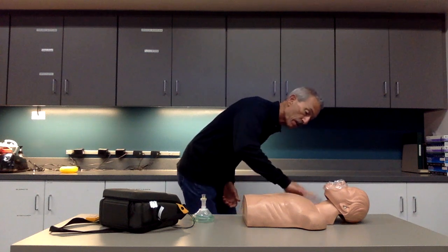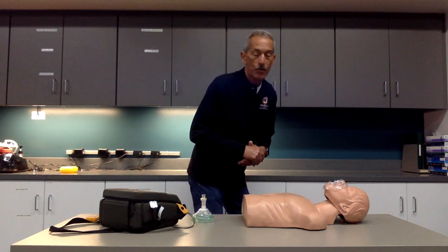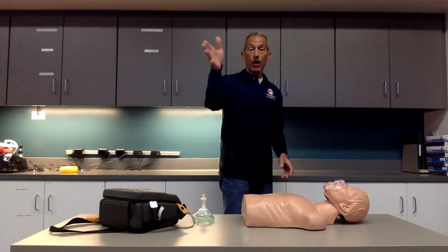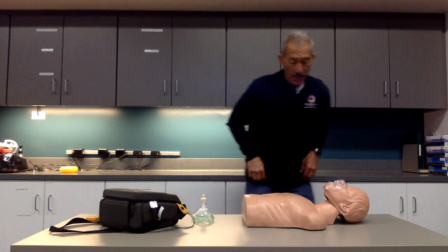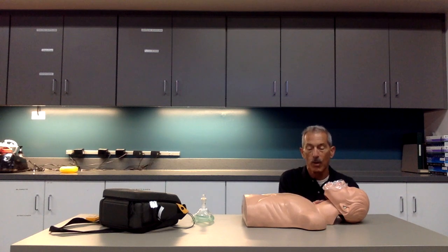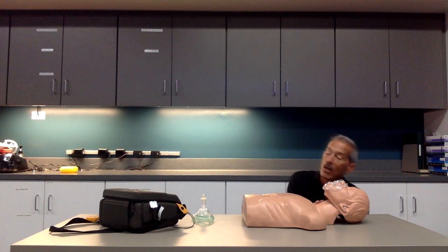Sir, wake up sir! No response to tap or shout. Trap squeeze, no response. Hey partner, get an AED and call ALS. Then I'm going to get down at the level of the patient and I'm counting pulse and breathing, no more than five to ten seconds.